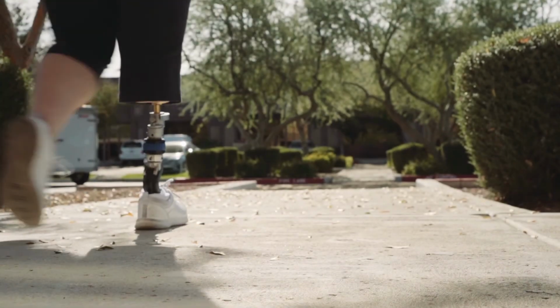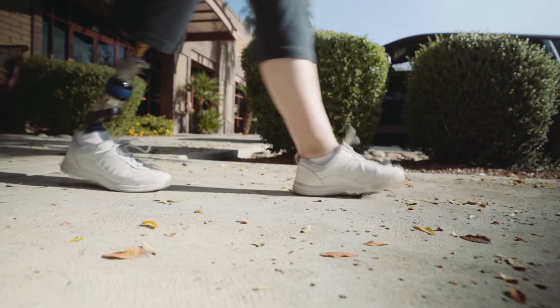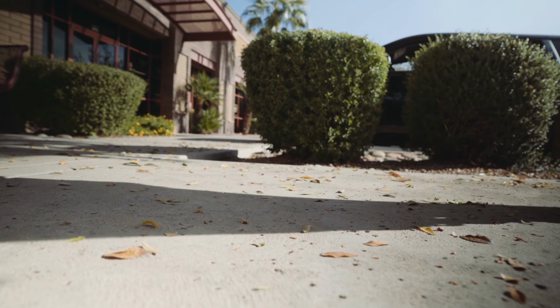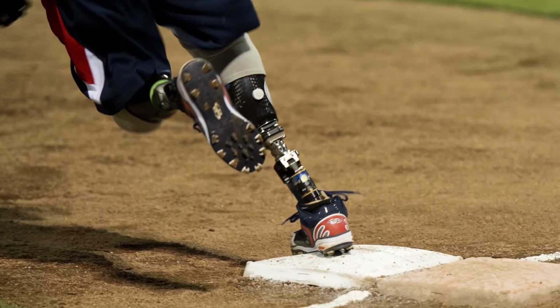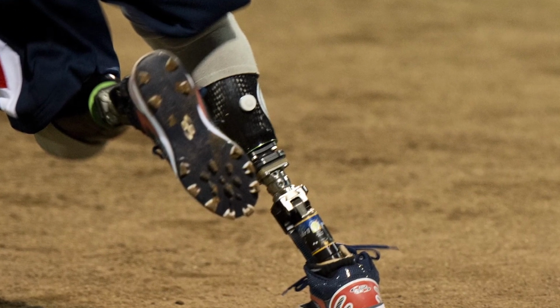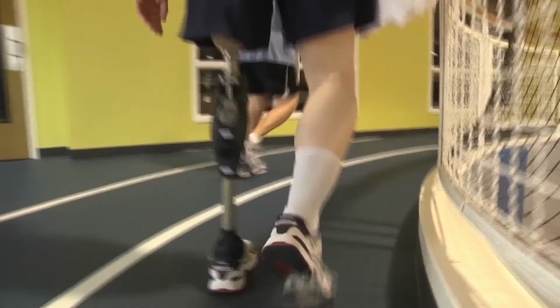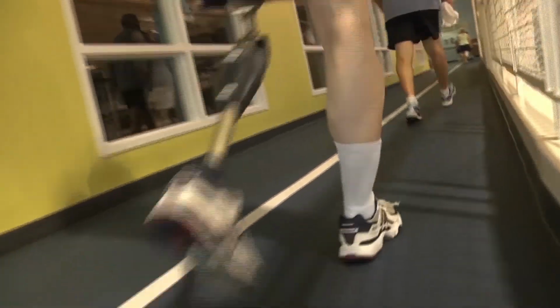When working with the prosthetic plan for osseointegrated patients, it is critical to understand the biomechanical differences once the socket is removed from the picture. One of the biggest differences is the amount of shock absorption and cushioning that is lost. In an intact leg, shock absorption comes from 3 places: the fat pad on the bottom of your heel, your ankle movement, and your knee movement. In traditional prosthetics, this is achieved through prosthetic components, but also some is achieved through the cushioning of an elastomeric liner and from the compliance of the tissue against the socket. These 2 shock absorbers are now gone, so much more care is needed to provide shock absorption to these patients.